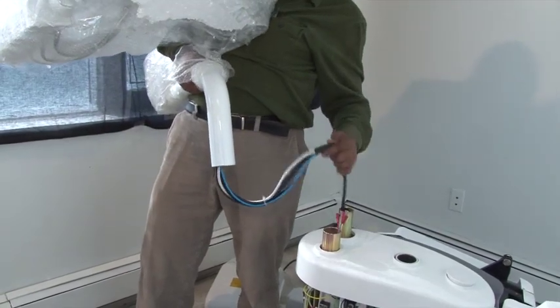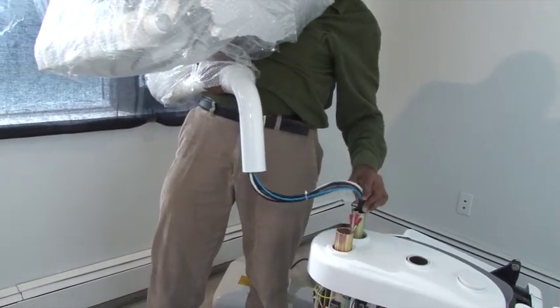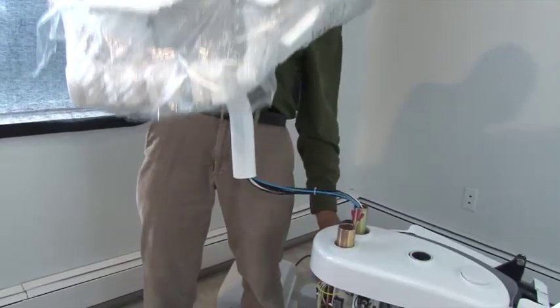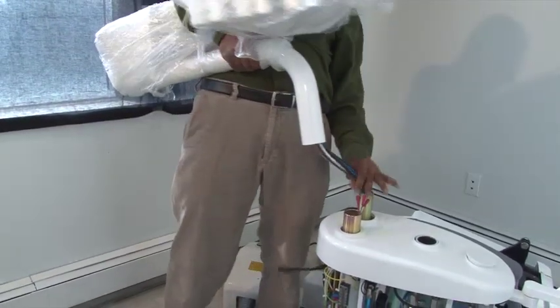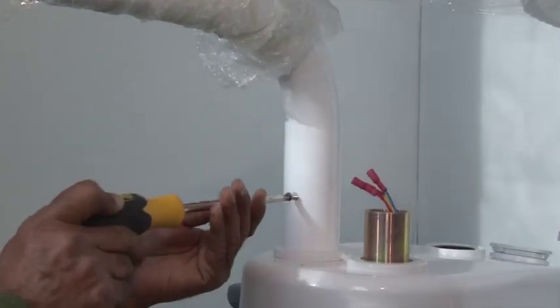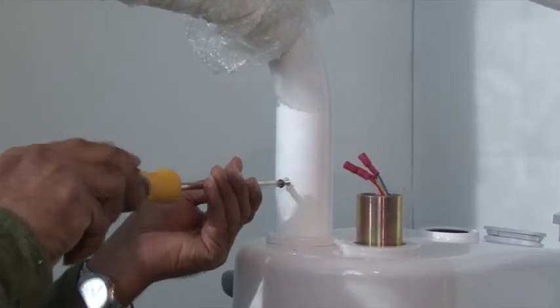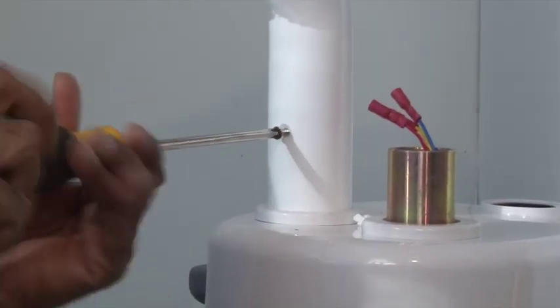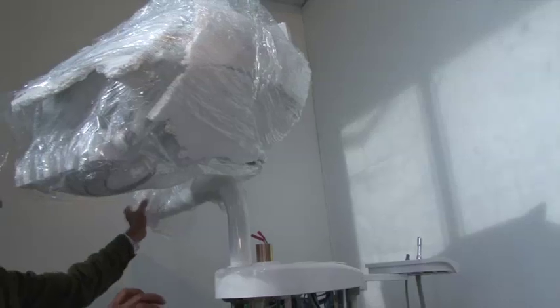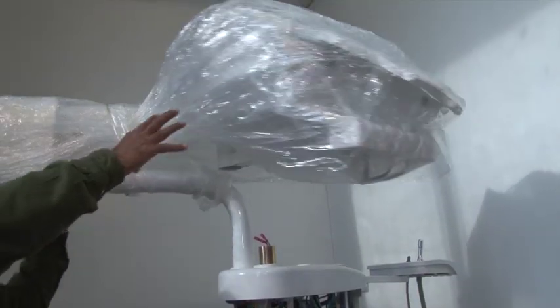Once the wire is inserted, you may insert the delivery tray pole into the pole holder. Make sure to keep the plastic ring cap safe to prevent any damage while inserting the pole. After the delivery tray pole is inserted, tighten the screw. The screw will secure the pole to the chair as well as control its movement.